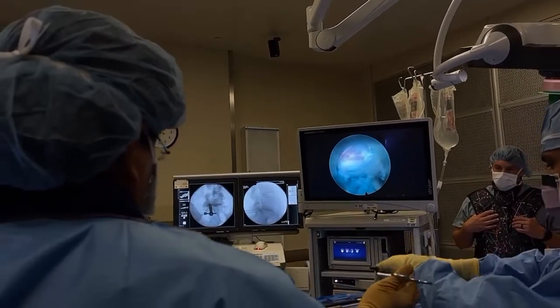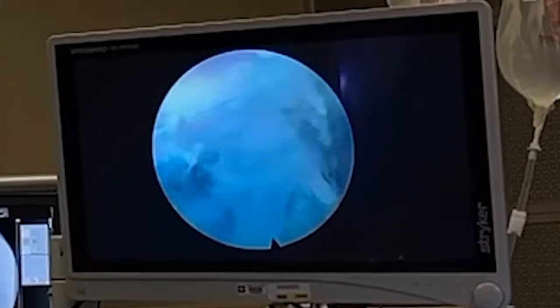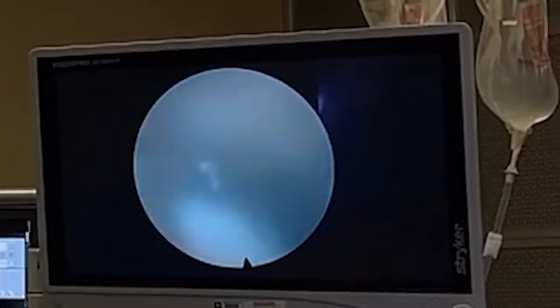Woo! Look at how scary that is. There's the dural tube. Right there. It's got a big vein going through it. It's going to start pulsating in a while. So I'm going to use this cannula to sweep over.